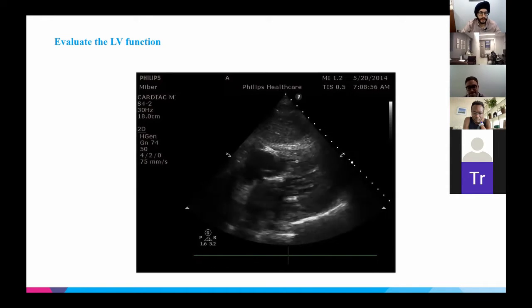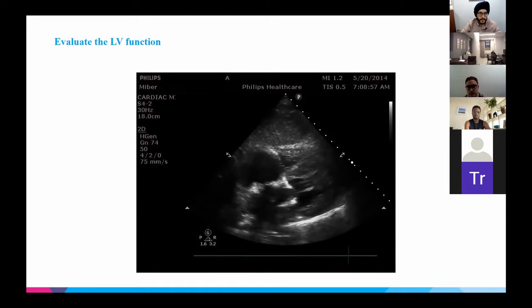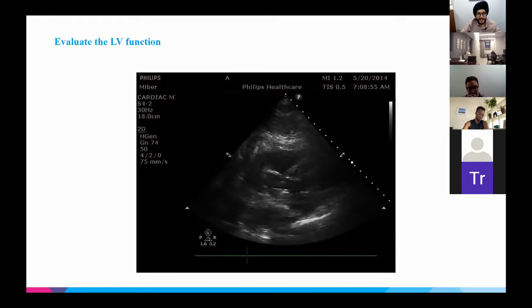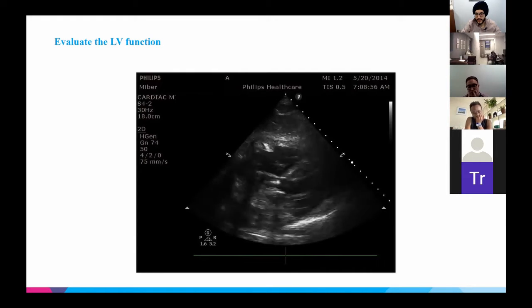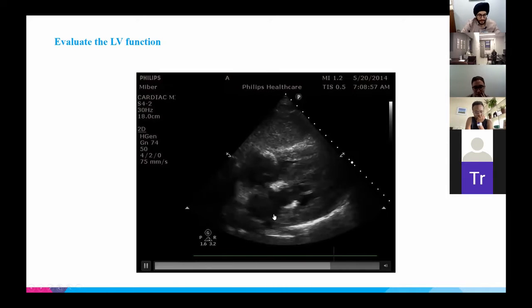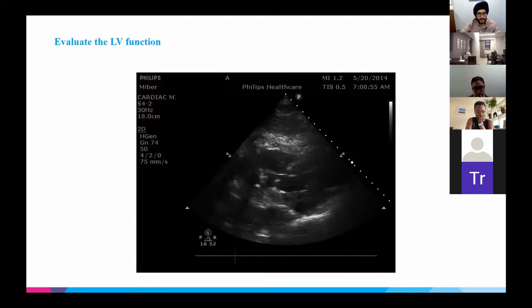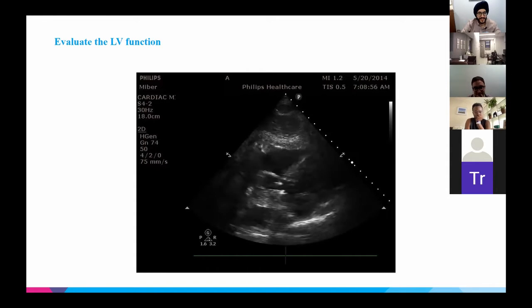Thirty responses. People are a little slower on this one. Oh, it's thinking. Yeah. I picked this clip because it's the reality of what some of our views are. We want our subcostal view to be a nice, pretty four-chamber view, but obviously this is sometimes the best we can get, so we just have to make our estimates with what we can see. Last five seconds. Just pick something. Yep. Okay.